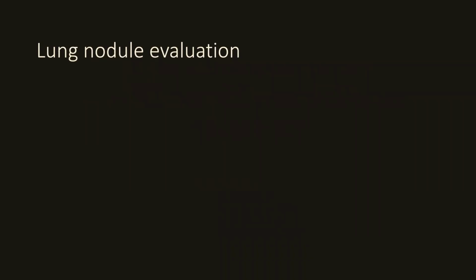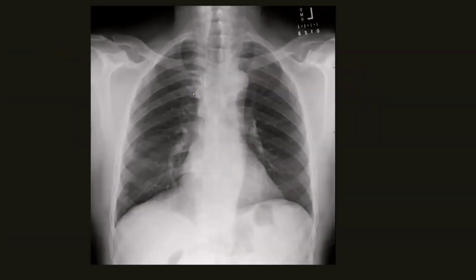So we've been using DDR for a little over a year now. We've had a lot of fun using it, and we're still trying to figure out how to tap into the full potential of this new modality. Just a simple area where it has some utility is in the assessment of lung nodules. Sometimes it's unclear whether a nodule is truly within the lungs or if it's in the chest wall.